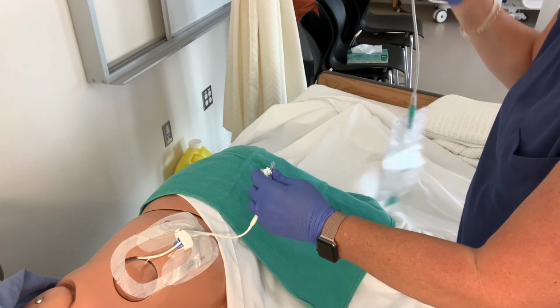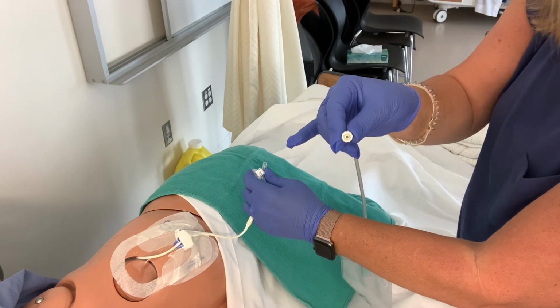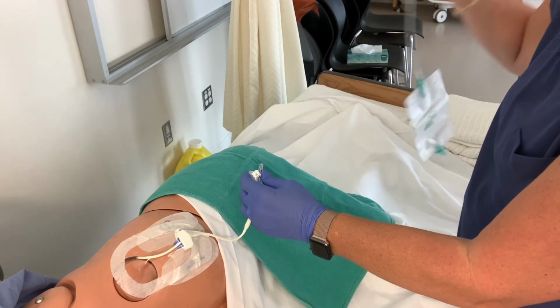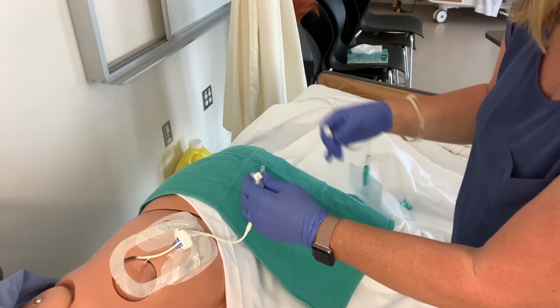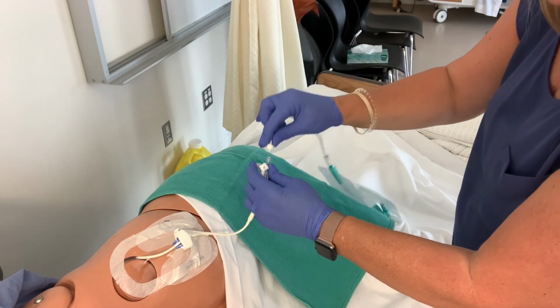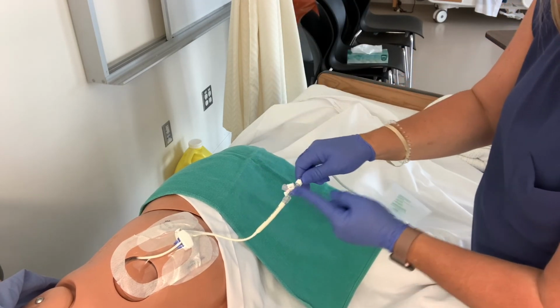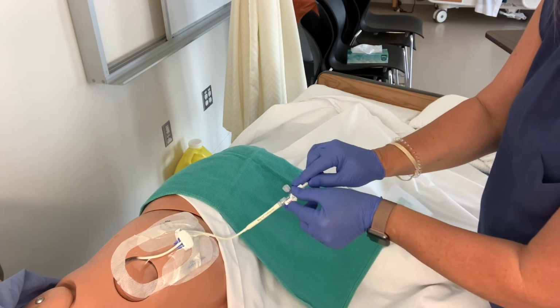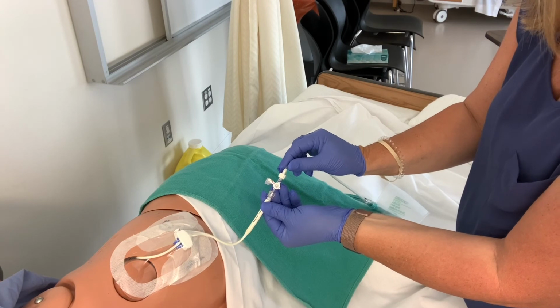And I would have assembled beside me a new bag and a port that needs to be kept sterile. So you might want to have your dressing tray open and sterile until you figure this part out. And then you're just going to pick it up and put it on and screw it tight. And then open your stopcock to your patient, so that it drains from the patient.